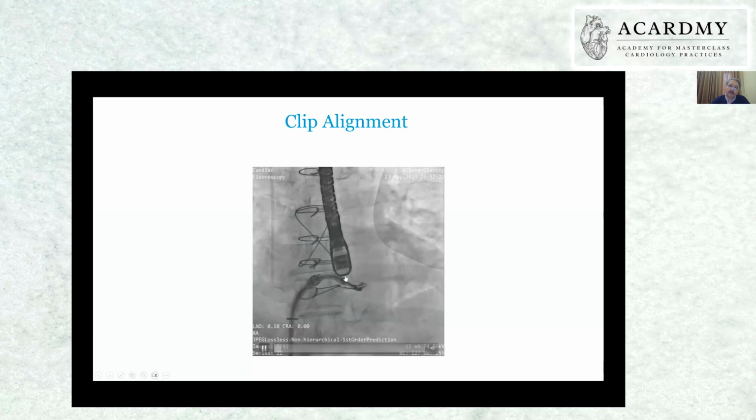And then this is the clip delivery system, CDS. Now this trajectory is very, very important. This trajectory we only get if we have a precise puncture and a good height. In the four chamber view, from the mitral annulus or from the line of coaptation, it has to be at least 4 centimeters above. If it is not, we will face problems. There are many rotations possible on the console of the MitraClip, but still it has to be a good puncture.